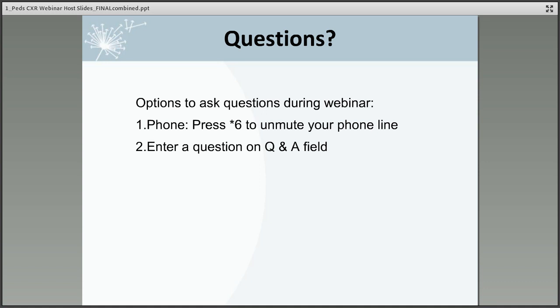Erica says, so do we not depend on radiographic improvement for clinical confirmation of pediatric cases? Very, very good question, because the CDC criteria are clinical class 3, so clinically improving or radiographically improving. Well, ironically, I sort of think the other way. If they have that immune reconstitution phenomenon where their lymph nodes in particular are getting bigger, but they're clinically improving, I go, yep, that was TB all right, but I run the list.